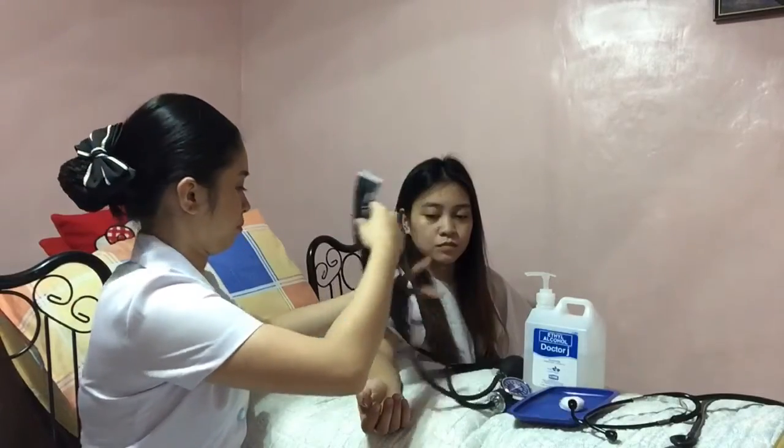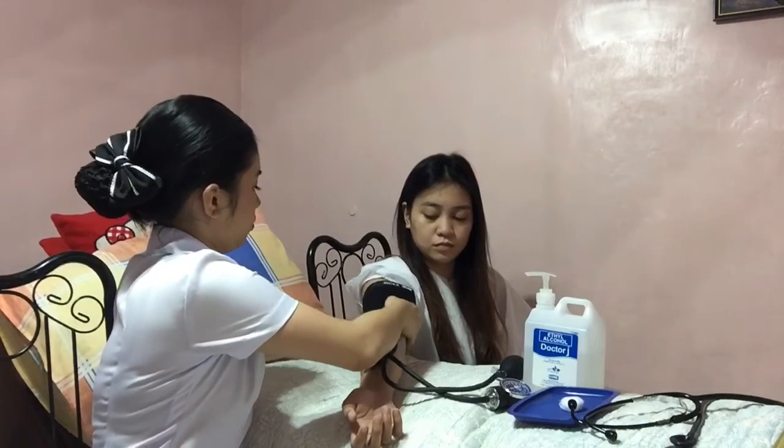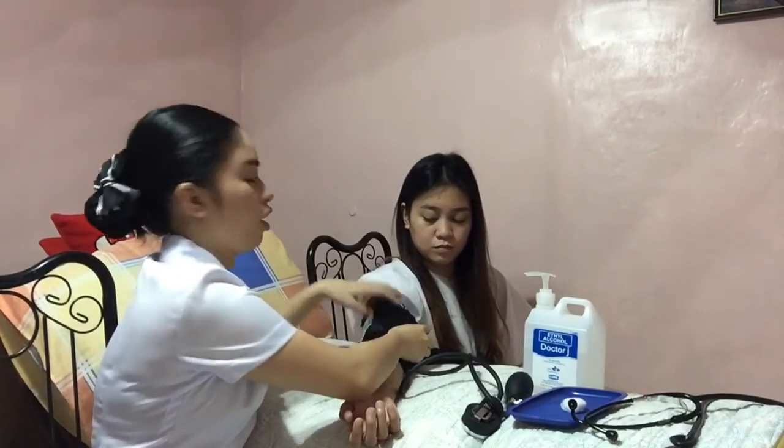So make sure that the patient has not smoked and ingested caffeine within 30 minutes prior to its measurement. So I'll say, did you smoke or ingest caffeine or energy drink? Okay. Wrap the deflated cuff evenly around the upper arm. Then locate the brachial artery.